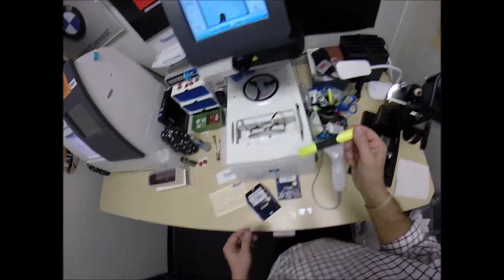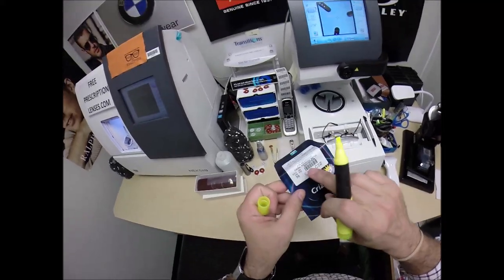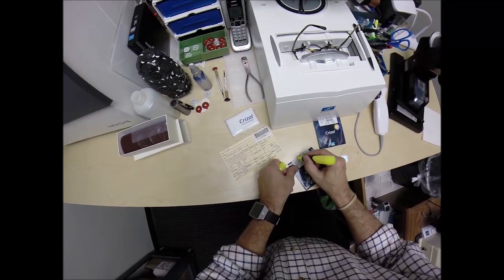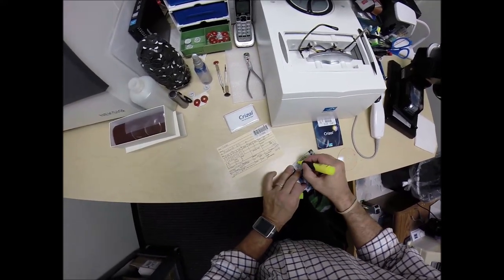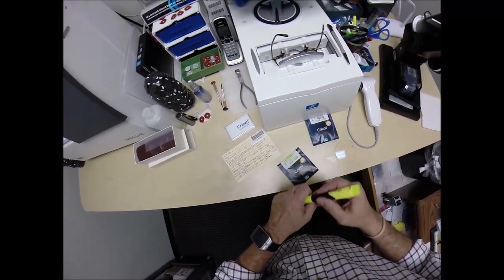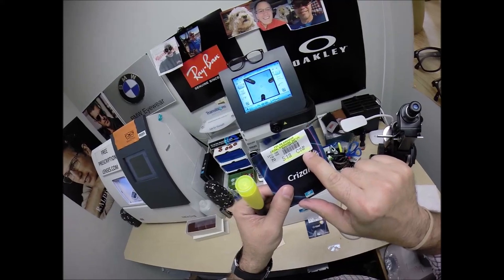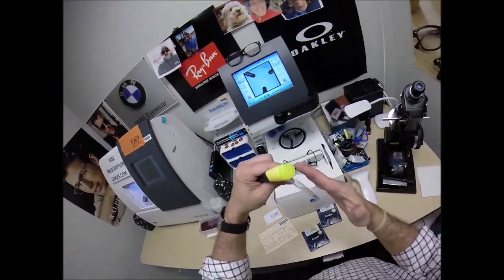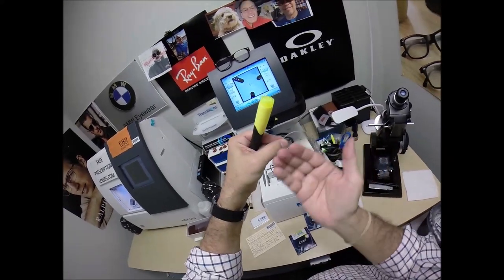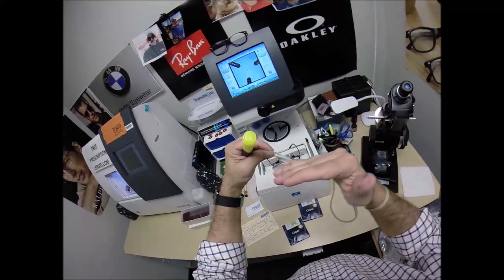I always highlight this so you know you're getting the original Essilor brand of Crizal Sapphire 360 UV. I'm highlighting the prescription of the right lens. There are two ways to write everything — a plus cylinder and a minus. Years ago they used to put the astigmatism correction on the front of the lens, and that's when it was known as plus cylinder. When it's on the back surface of the lens, it is now minus.